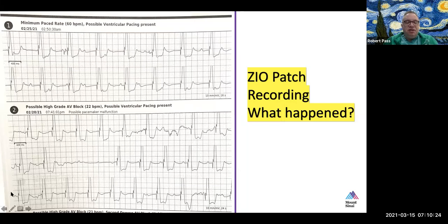Yes, you will potentially avoid oversensing things on the ventricular lead that you ought not to be oversensing, but you also could undersense a PVC, and you could potentially put a paced complex on a T wave and cause life-threatening ventricular arrhythmia. So you really do need pacemakers to be able to sense as well as pace.